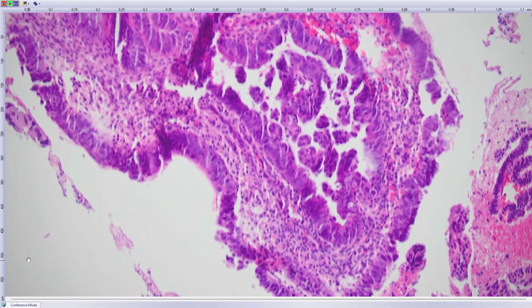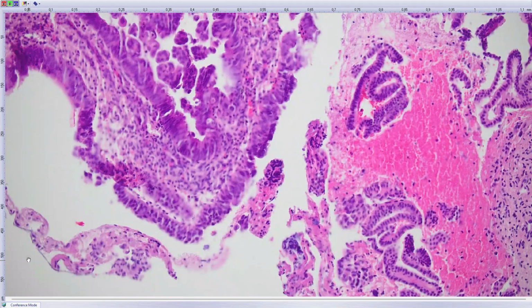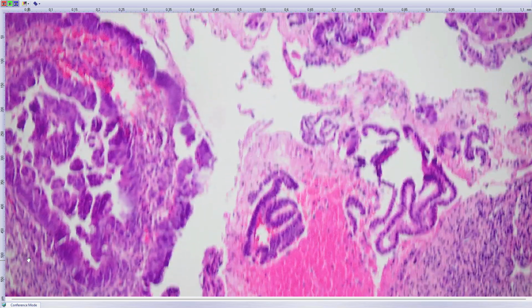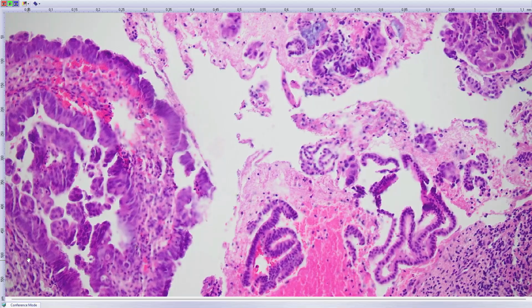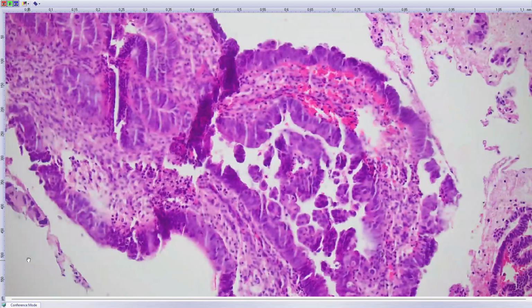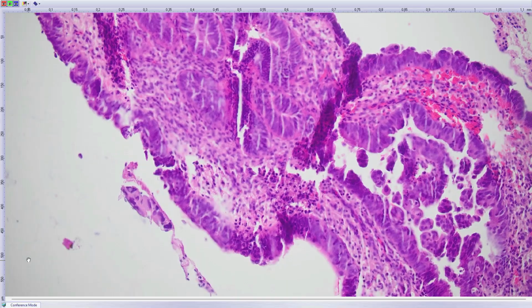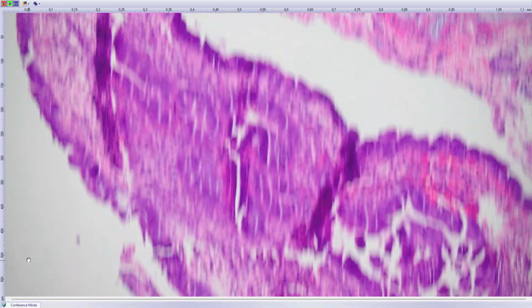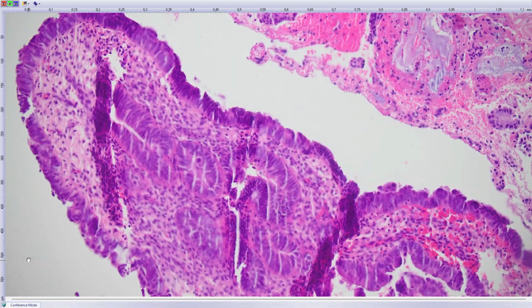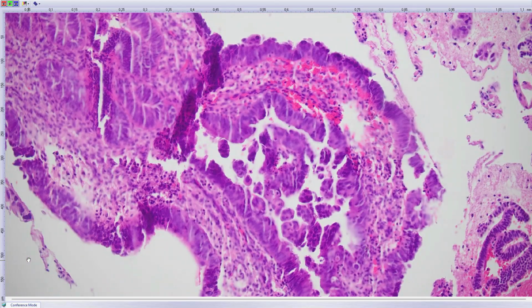Yes, it is serous carcinoma arising in the polyp, and the take-home message here, especially for the residents, is that every time you have very typical lesion of corporal endometrial polyp, especially in older patients, there can be a probability of some malignancy arising in the setting of otherwise typical atrophic type of the polyp, and the malignancy can be either endometrioid carcinoma or serous carcinoma or other types of Müllerian derived tumors.